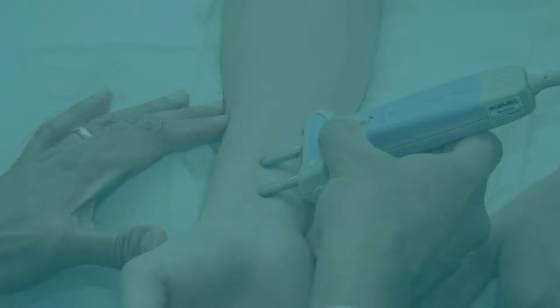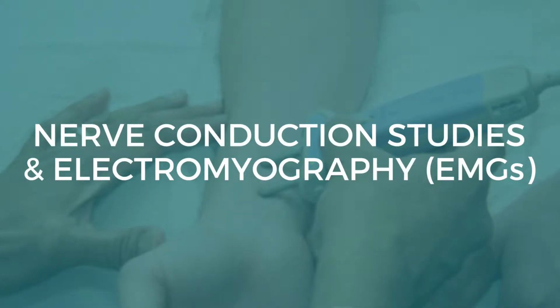I am a rehab physician, also known as a physical medicine and rehabilitation specialist. I'm going to tell you a little bit about nerve conduction studies and EMGs. When patients come in to see me, they often have problems with either numbness, tingling, pain, or weakness.